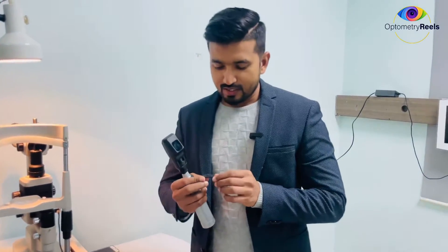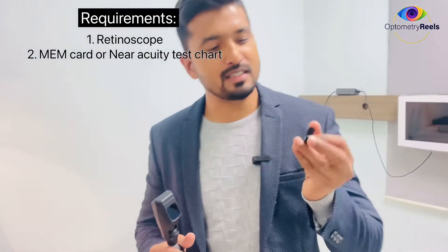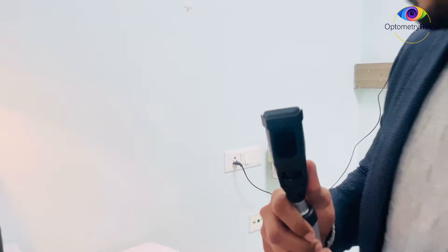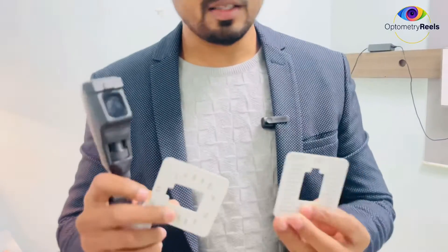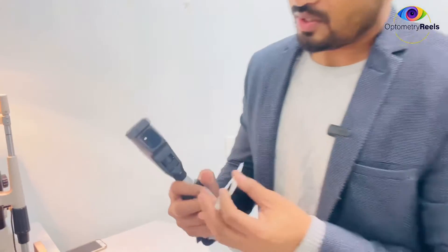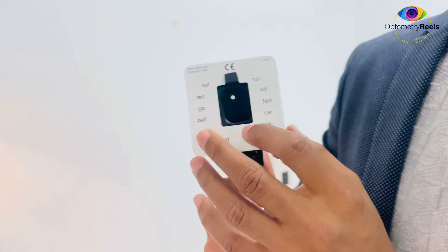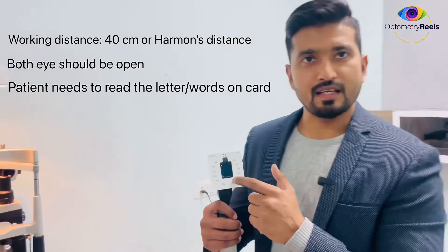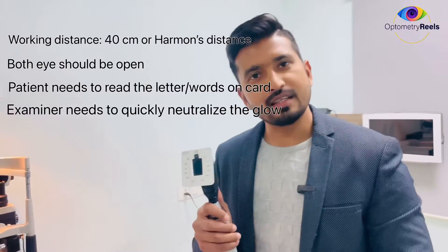Let me show you how this procedure is done. You require a MEM card, but before that, you can see this is a clip which needs to be attached to the retinoscope, and we have a couple of MEM cards. This card is placed onto the retinoscope. Now you can see the attachment — the patient has to read this at a distance of 40 centimeters while the examiner looks inside the patient's eye while neutralizing the reflex.